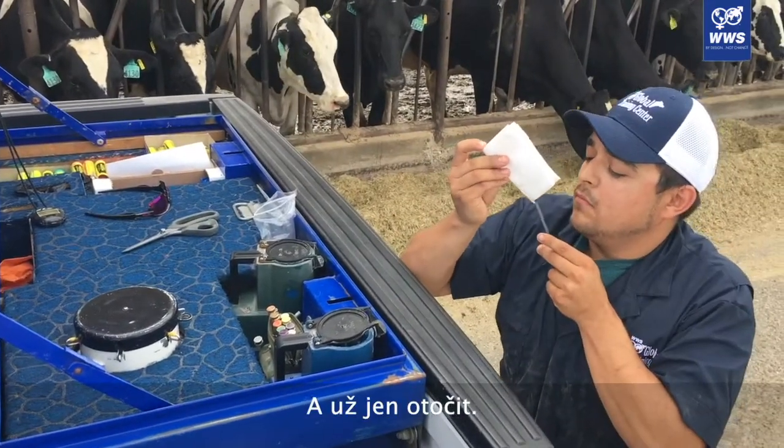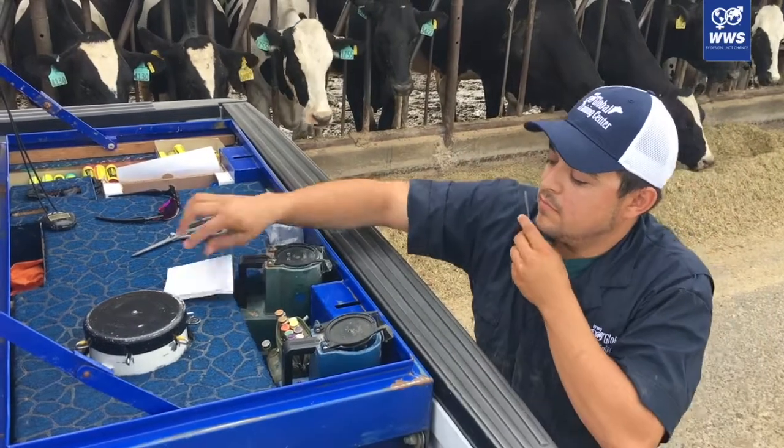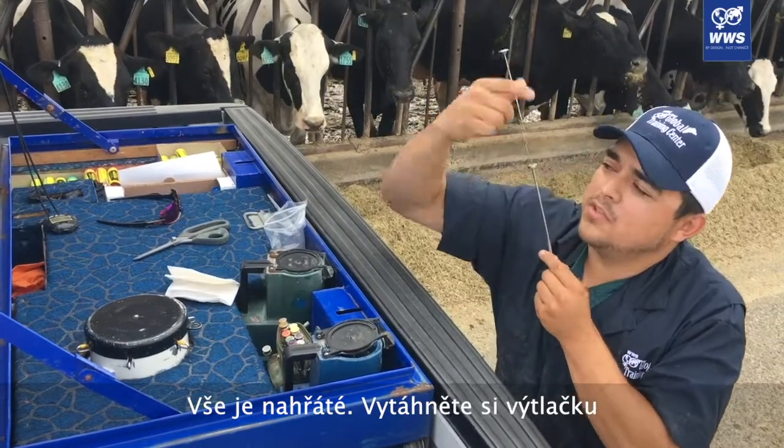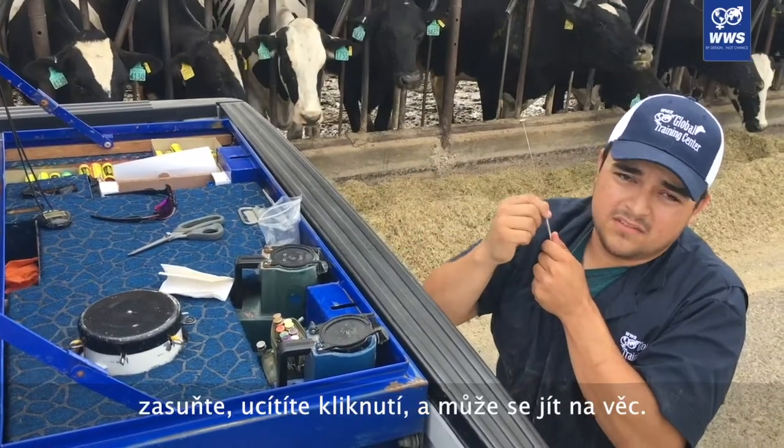Flip it over, put it in the straw, warm cup, sheet, pull up the plunger, drop it, click — we're good to go.